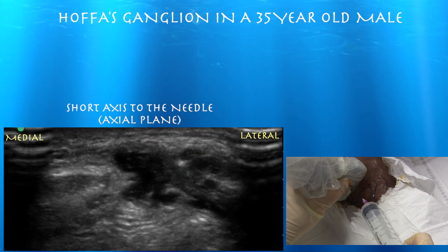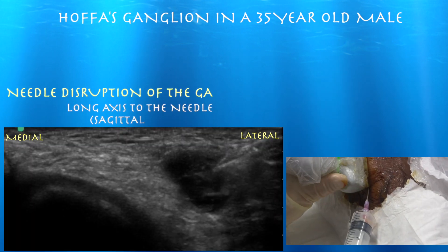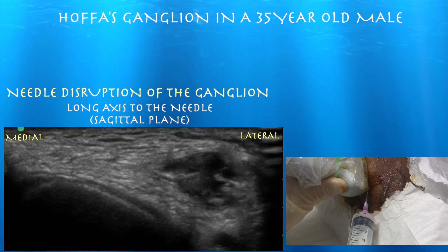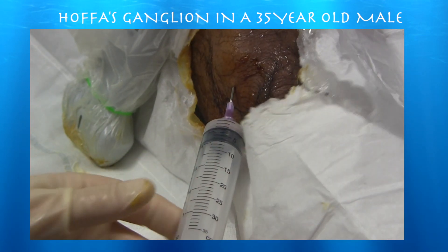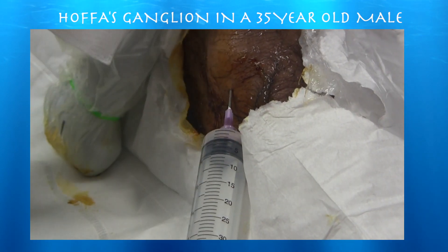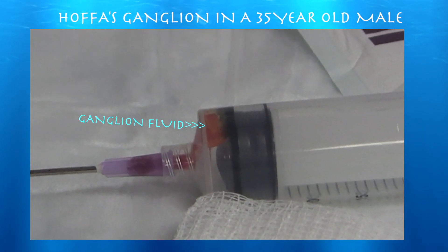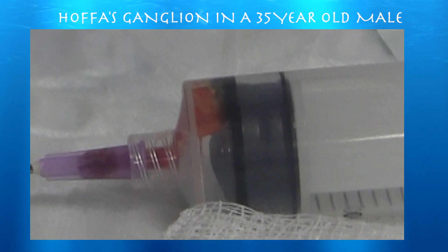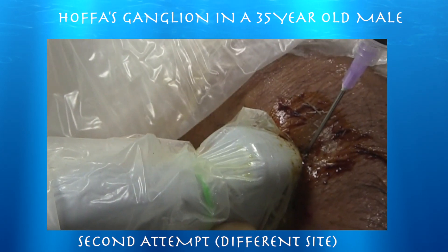Here we can just see the needle tip — it gives you a good sense of where you are medially or laterally. If I don't get it all, at least I'll break it up. It might just kind of disintegrate quickly. And here's that thick ganglion type fluid. Unfortunately I only got a little bit out, but there's probably more than you would think, because there's most likely fluid within the needle shaft itself, and this is a thick needle shaft.